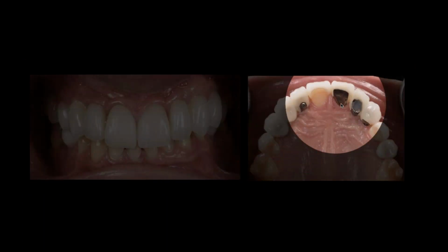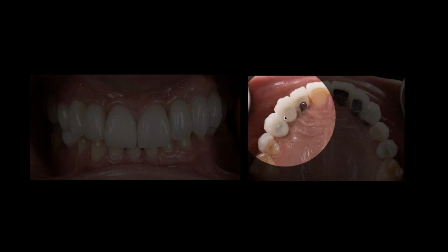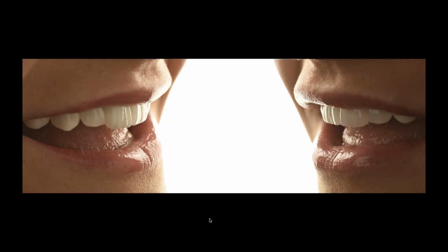I have a veneer. I have a metal ceramic PFM next to it. I have 2 implants with set screws on the lingual, full coverage, another veneer, right? So a lot of different types of restorations. And like I said, the restorative options really were only critical after I understood where those restorative options worked, where the teeth belonged in that patient's face. And again, that to me is always the most important part of that photographic communication.